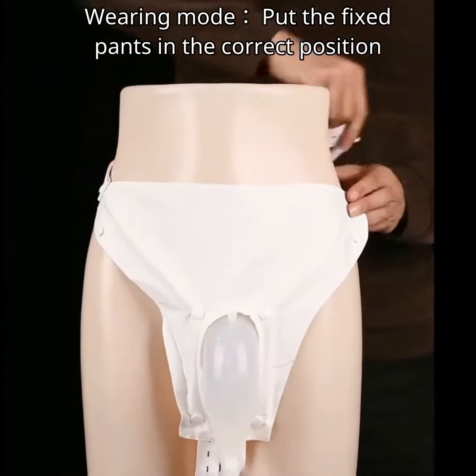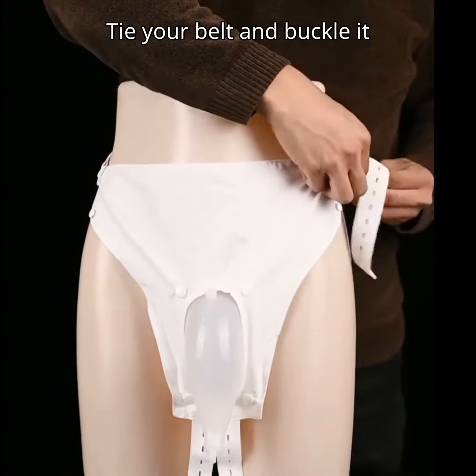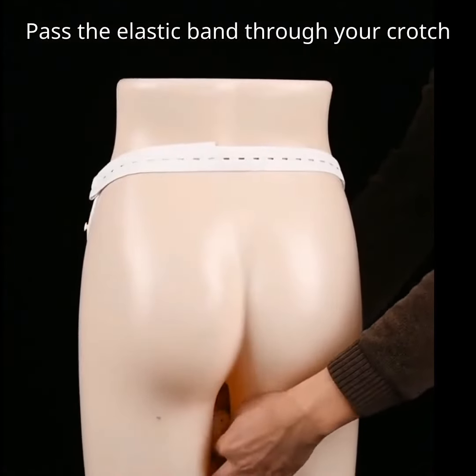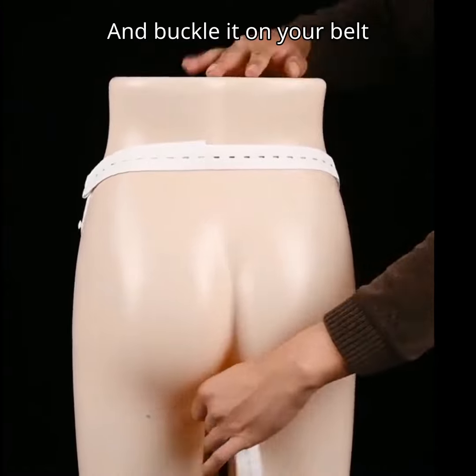Wearing mode: put the fixed pants in the correct position. Tie your belt and buckle it. Pass the elastic band through your crotch and buckle it on your belt.